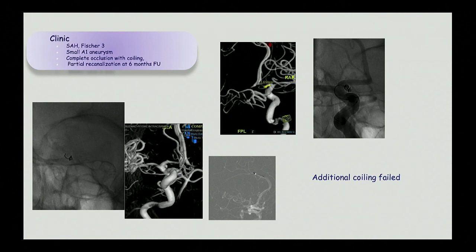This was another case. So again, sometimes you treat a small aneurysm, and it may be difficult to follow up with MR, and it could be difficult cases. This was a patient who bled before, so has a subarachnoid hemorrhage, and the aneurysm was here, a very small aneurysm at the end of the internal carotid artery, exactly at the beginning of A1. So we have a bleeding, we have a small aneurysm at this location. It was treated by my colleague.